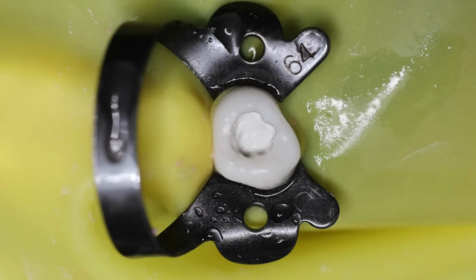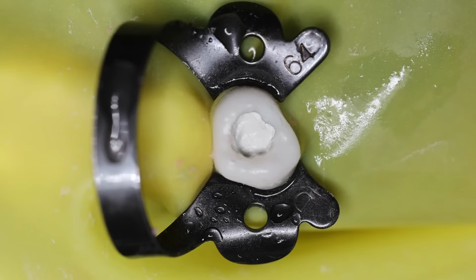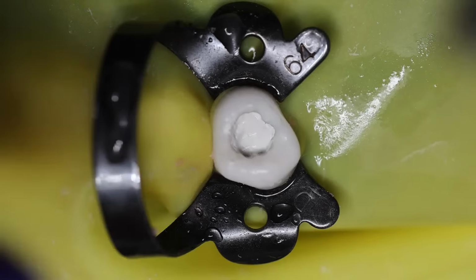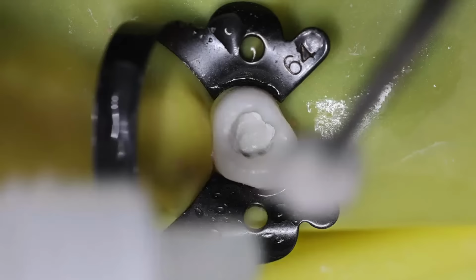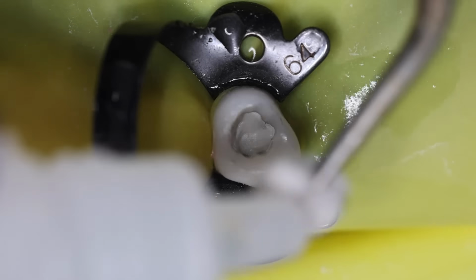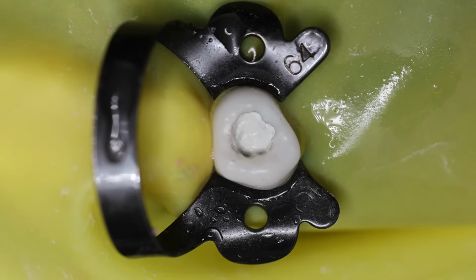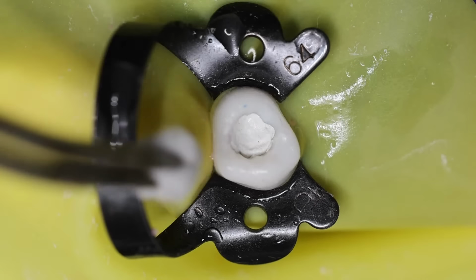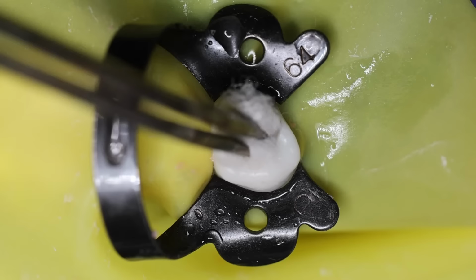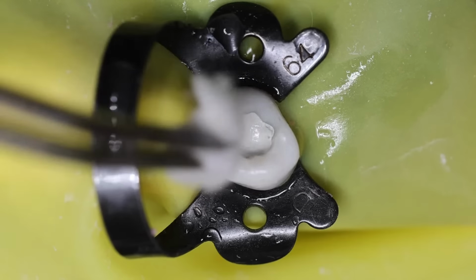Now what you can do is just have a simple cotton, and this cotton should be soaked in water, or we can also use this MTA liquid and soak it in this liquid itself. Okay, just soak it and condense the MTA. Now you can see that MTA is well condensed into the cavity.